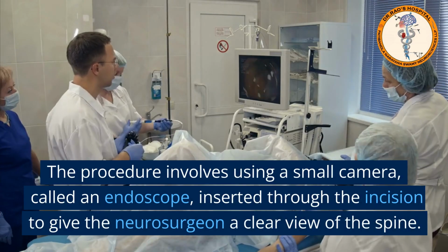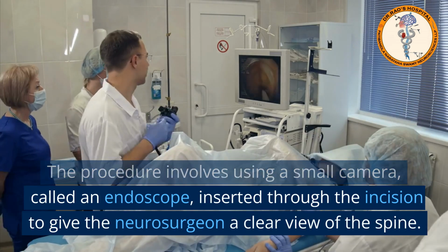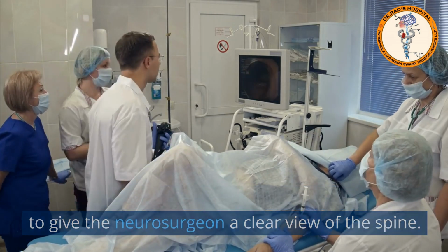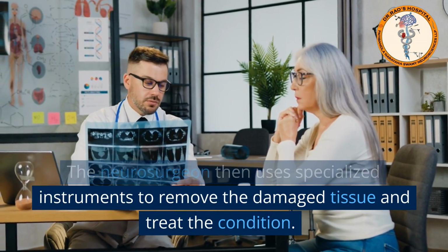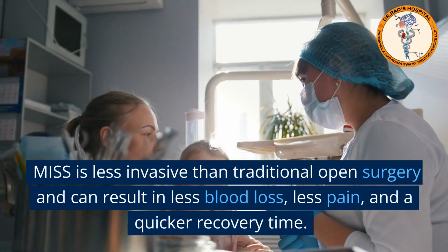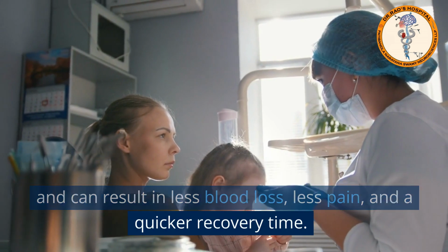The procedure involves using a small camera, called an endoscope, inserted through the incision to give the neurosurgeon a clear view of the spine. The neurosurgeon then uses specialized instruments to remove the damaged tissue and treat the condition. MIS is less invasive than traditional open surgery and can result in less blood loss, less pain, and a quicker recovery time.